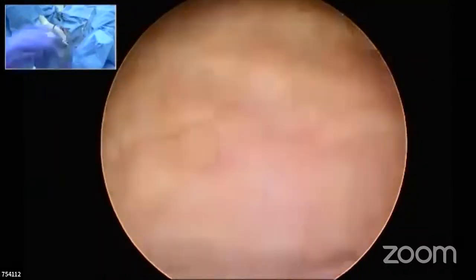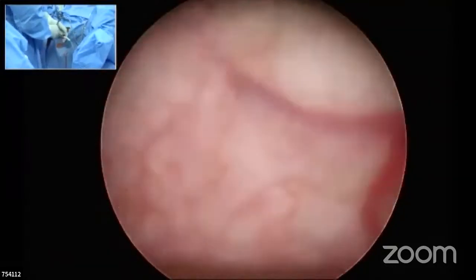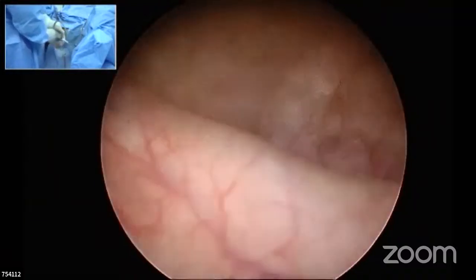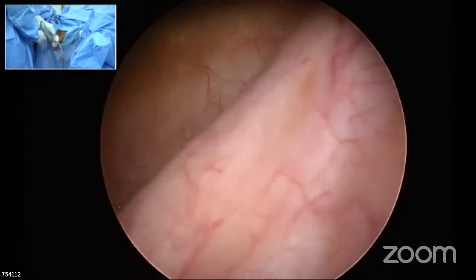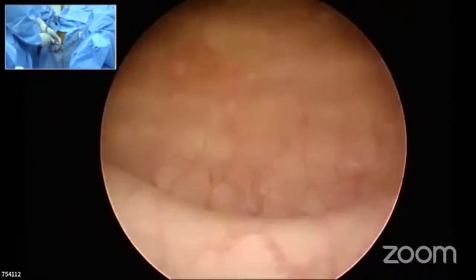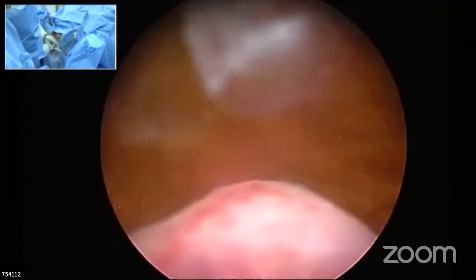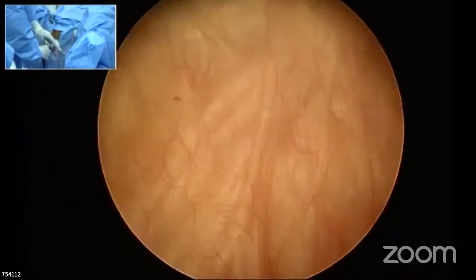And I've entered into the bladder. In the bladder, the first thing I see is any presence of stones. I don't see any stone. There are some small calculi-like things seen, and you identify the ureteric orifices. I can see the left ureteric orifice. I can see the right ureteric orifice without any trouble across the median lobe. So I can feel a little more confident about my resection.